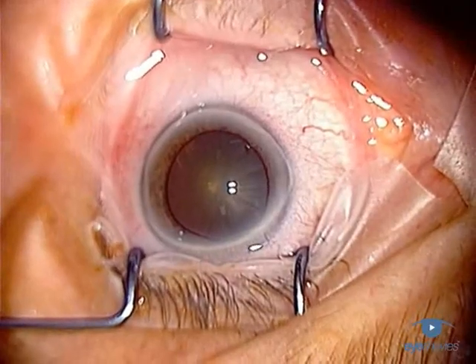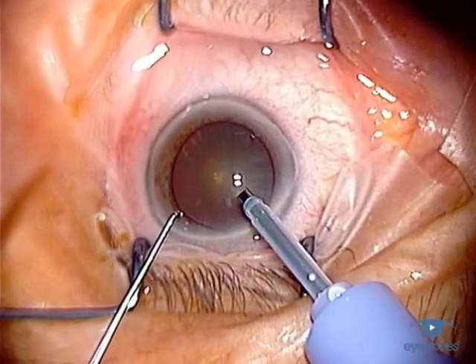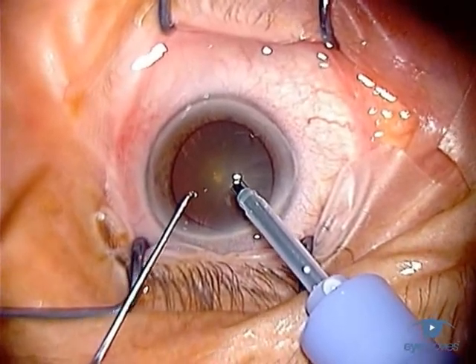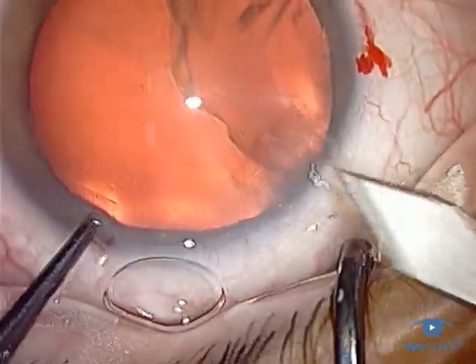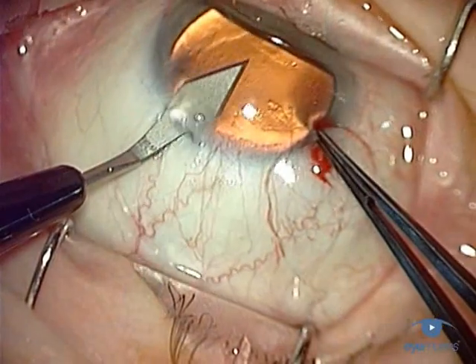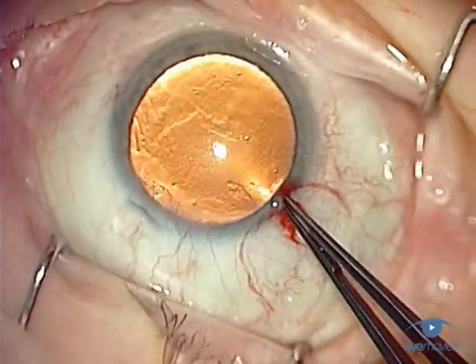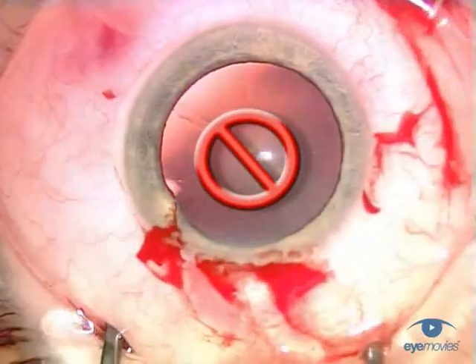Wherever you do choose to sit, try and place the incision where it's comfortable for you to handle the instruments. This means that if you're right-handed and operating from above, then put the incision between 10 and 11 o'clock, and if you're left-handed, then put it between 1 and 2 o'clock. Try to avoid the 12 o'clock position, which, although aesthetically symmetrical, everybody finds uncomfortable.